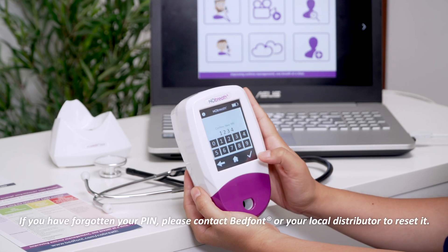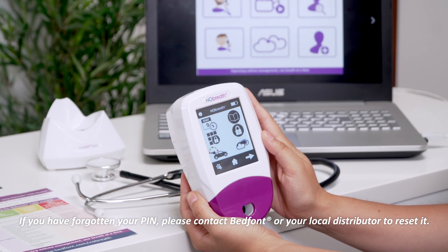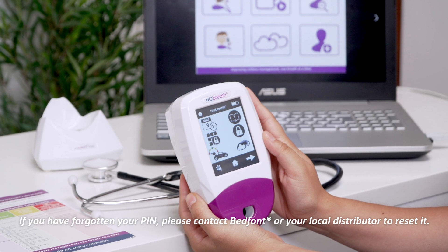If at any point you change your mind, press the back arrow to return to the previous screen or the home icon to return to the main screen.